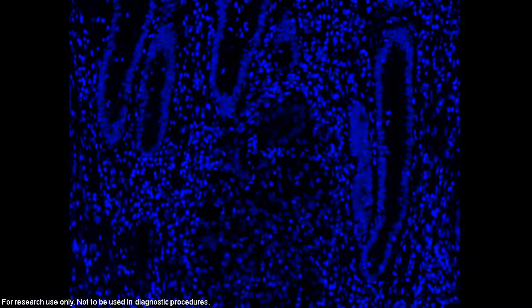Multiplex immunohistochemistry is a powerful tool, and it allows us to visualize the context of target protein expression within human disease tissues. Unlike other methods, for example flow cytometry, which is a fantastic tool but is limited, it provides context to your sample type, say healthy versus disease, perhaps your cell type specific context, a CD3, CD4 double positive cell. But multiplex IHC adds on another layer, and that's the spatial context within the tissue.